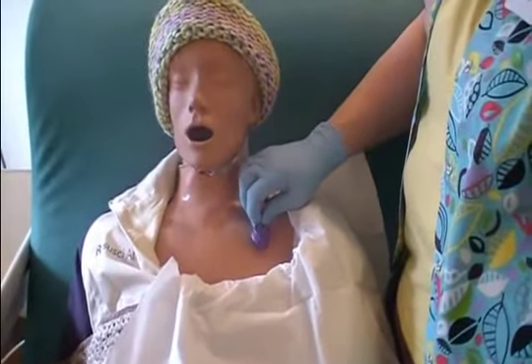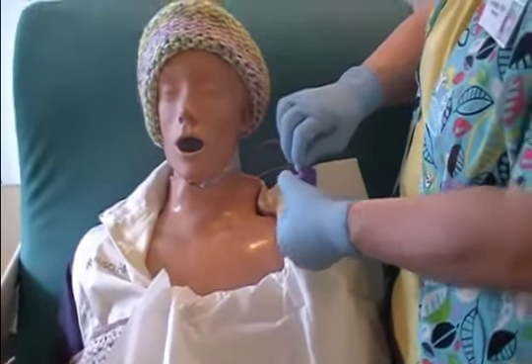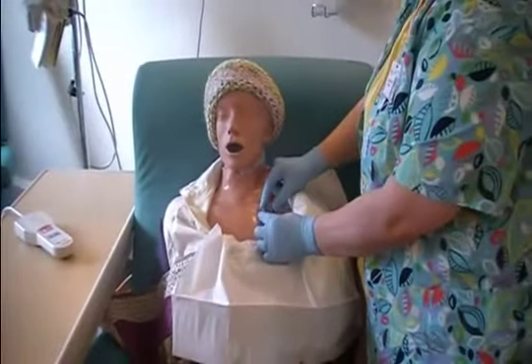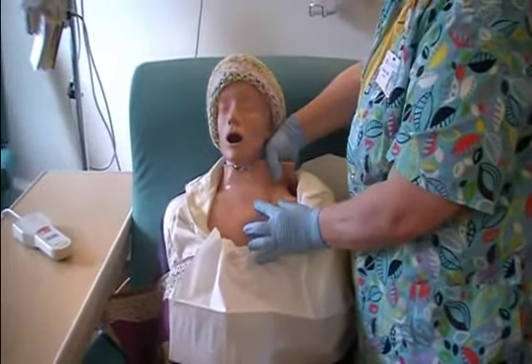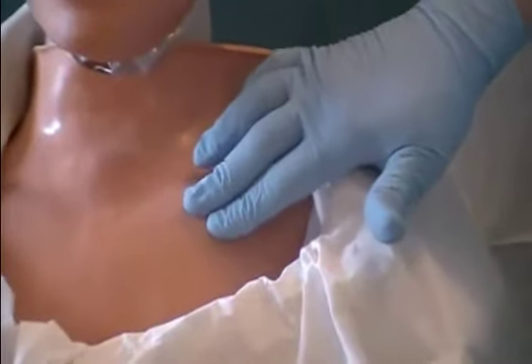Ports do move around a little bit, even if they're stitched in, because they do have these soft rubber places where the surgeon can stitch them in to try to help hold them in place, but they don't always stay there. So palpating that port is important. Even before I put on my clean gloves, I have clean sterilized hands — I palpate to see where that port is under the skin. Most of the time you can tell that there's a bulge in the skin.